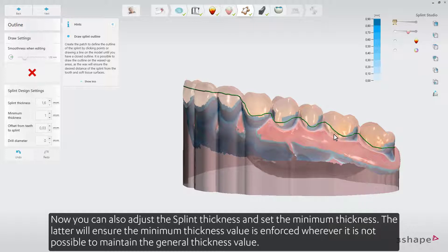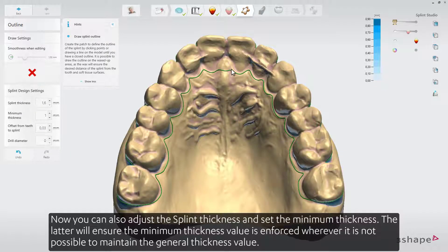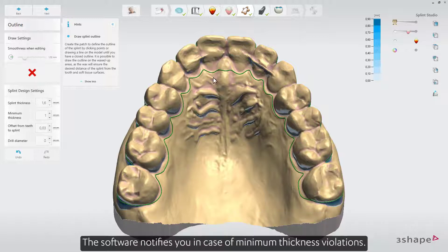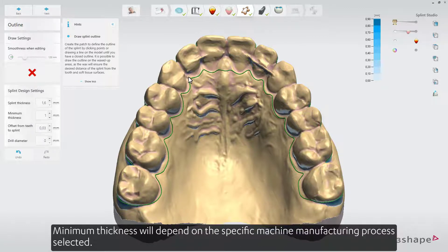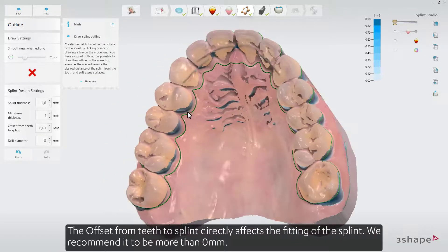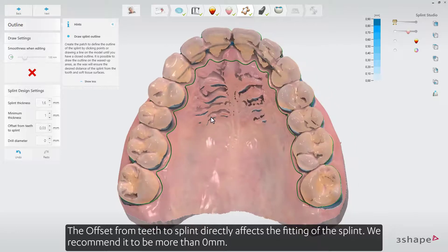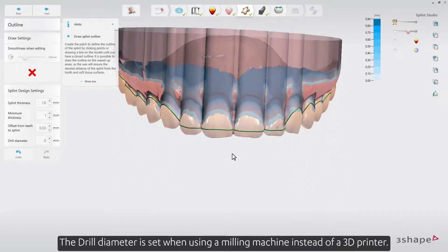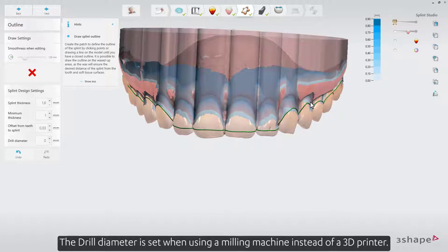Now you can also adjust the splint thickness and set the minimum thickness. The latter will ensure that the minimum thickness value is enforced wherever it is not possible to maintain the general thickness value. The software notifies you in case of minimum thickness violations. Minimum thickness will depend on the specific machine manufacturing process selected. The offset from teeth to splint directly affects the fitting of the splint; we recommend it to be more than 0 millimeters. The drill diameter is set when using a milling machine instead of a 3D printer.